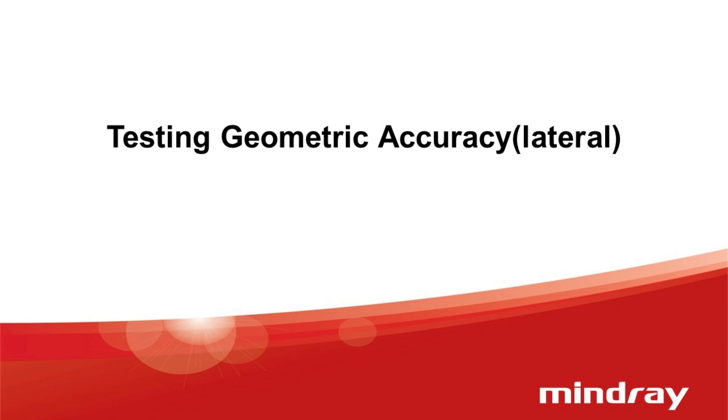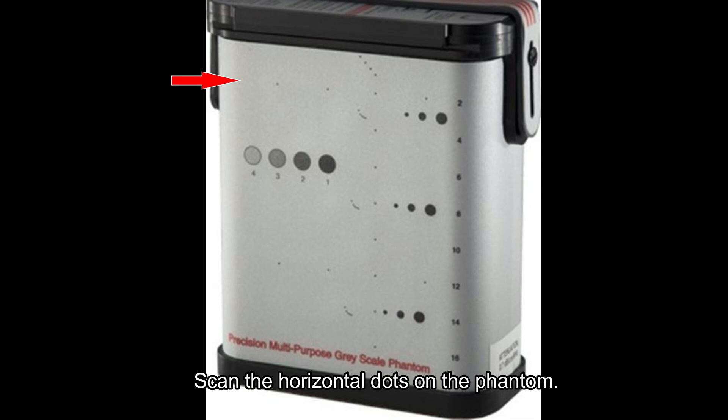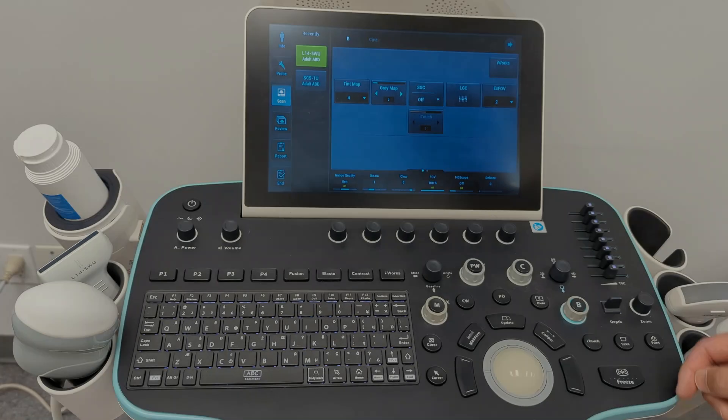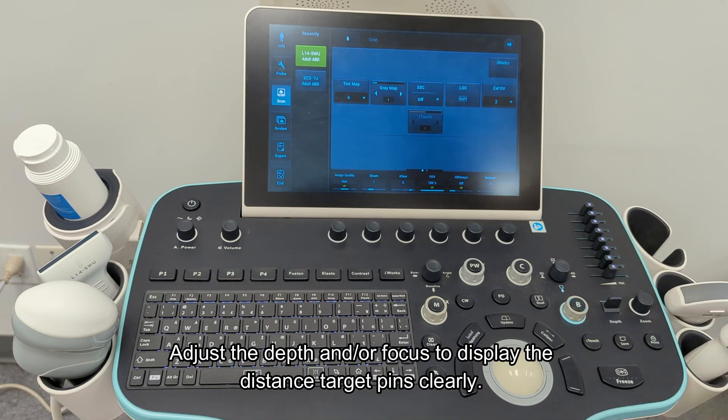Testing geometric accuracy: lateral. Scan the horizontal dots on the phantom. The lateral targets on the Gammex 403GS-LE are 30 millimeters apart. Adjust the depth and/or focus to display the distance target pins clearly.